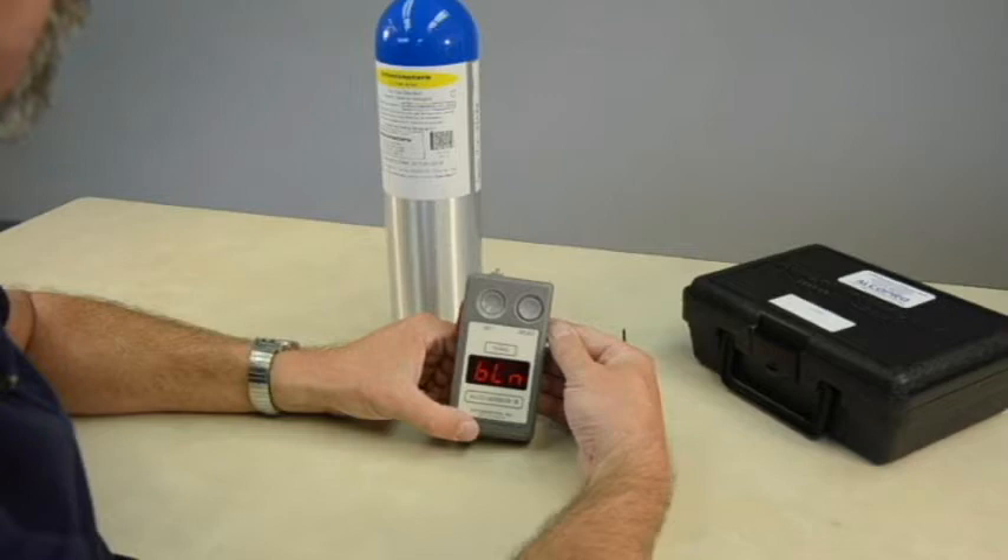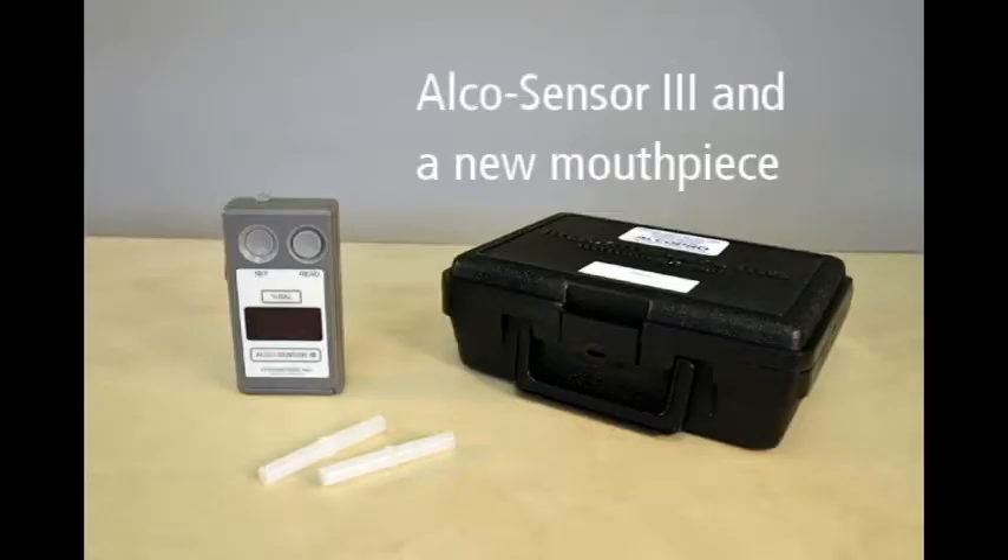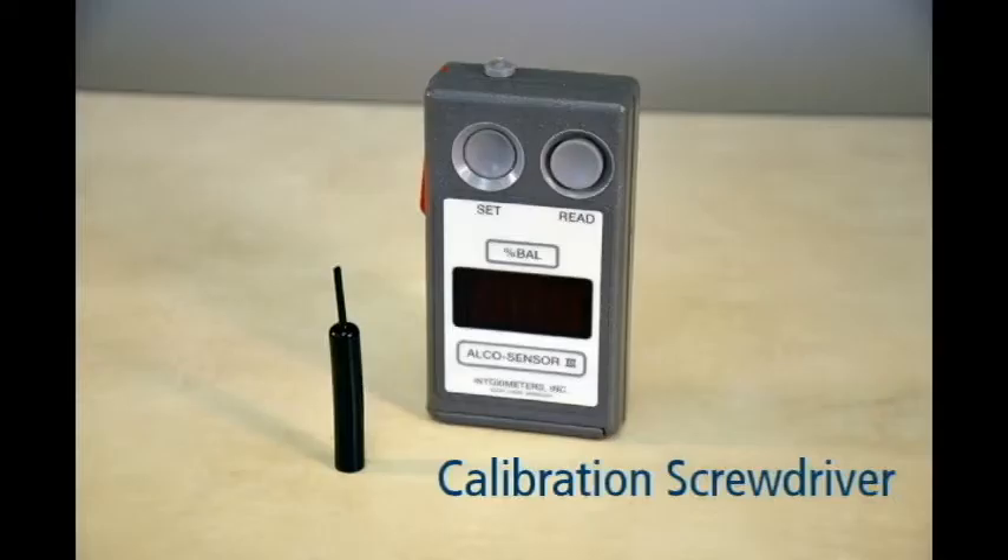This video shows the steps for performing a calibration adjustment on the AlkaSensor 3 breath alcohol instrument using an alcohol gas standard. To perform a calibration adjustment, you will need the following materials: your AlkaSensor 3 device and a new mouthpiece, and the calibration screwdriver that came with your device.